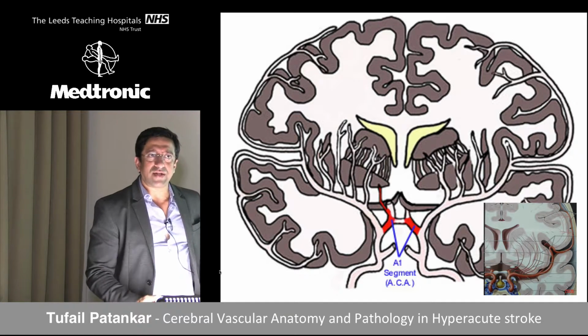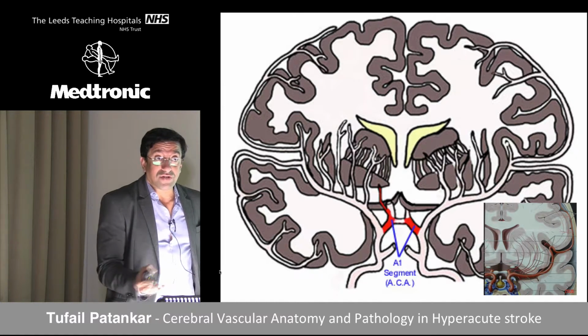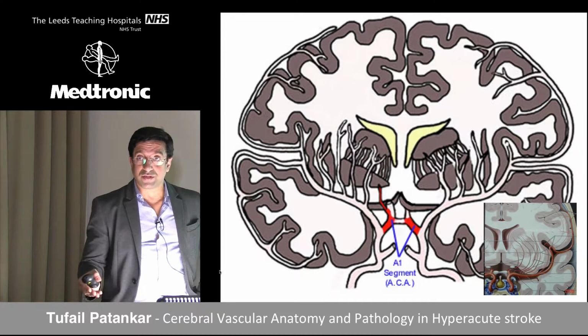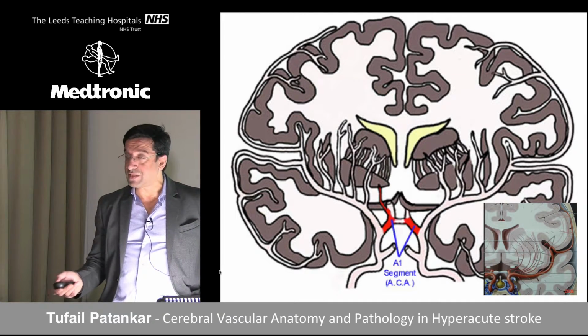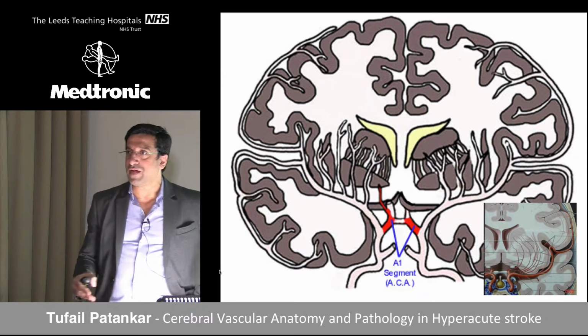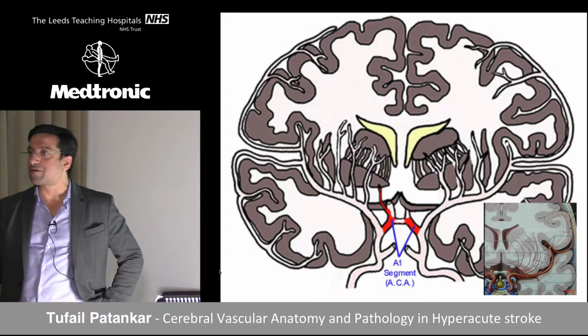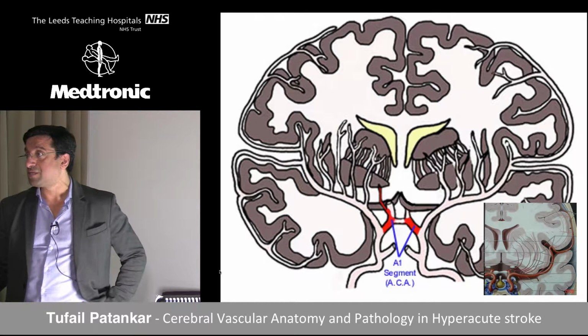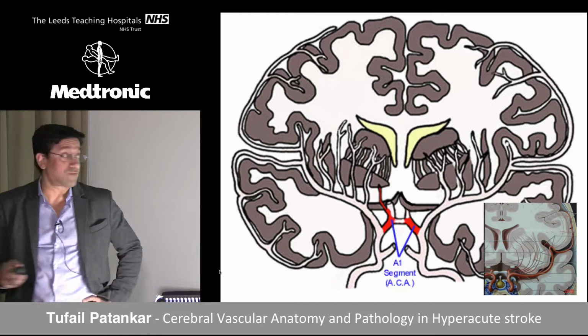So you can estimate, every patient is different. I think our treatment is evolving, and I think in time we'll be doing this as we do aneurysms, okay? We will change, our practice will change. At the moment we are like plumbers, aren't we? Just go in, take the clot out, but in time, we'll have to start thinking, do we need to take the clot out in every patient? Does it matter? Some people will have good collateral.